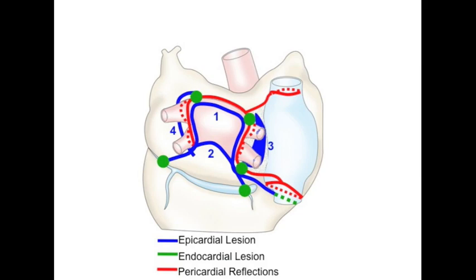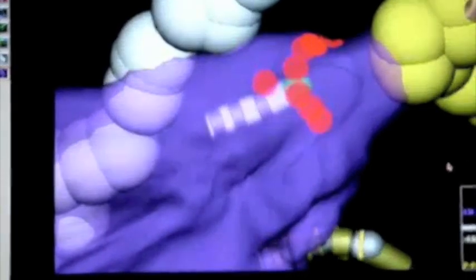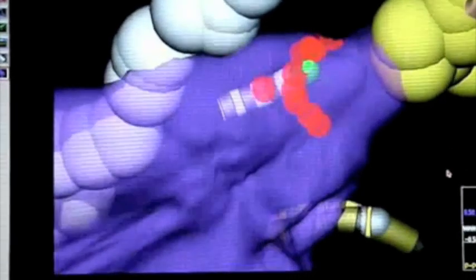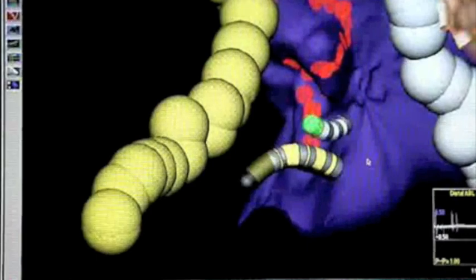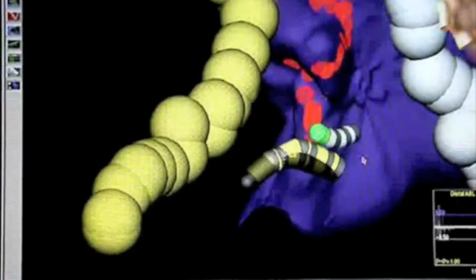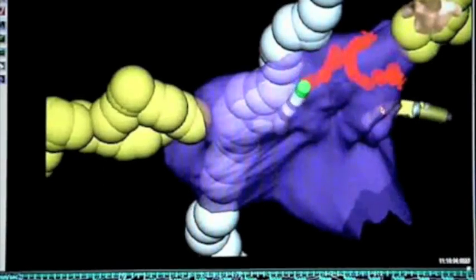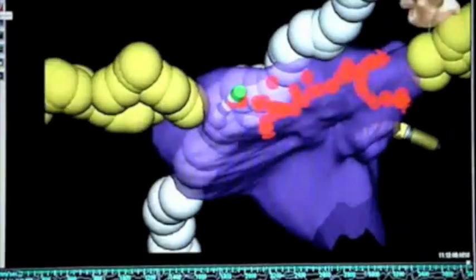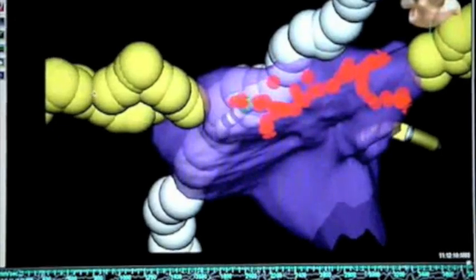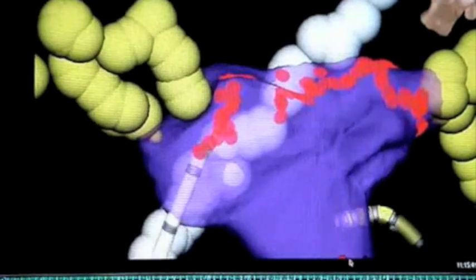Nonetheless, as you can see here, there remain areas that are not touched with the N-Contact epicardial approach, and we approach those with standard endocardial ablation. Utilizing an advanced three-dimensional electro-anatomical mapping system, we ablate inside the heart. We complete the lines, as there are generally specific areas along the anterior aspect of the pulmonary veins that need to be approached.